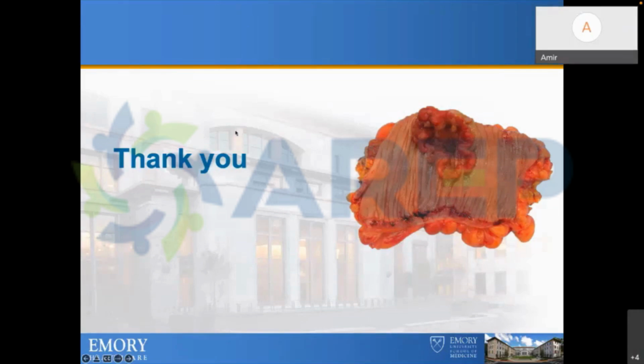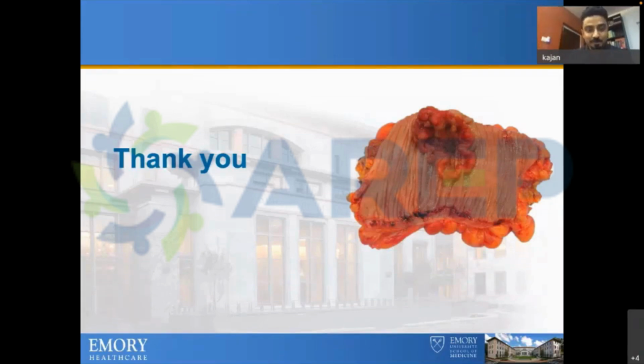Thank you, Dr. Amir. That was really a wonderful talk, very elaborate and very illustrative throughout, from the protocol to staging to restaging. And I fully agree about using a structured template, which kind of gives you a checklist also. I have a question from one of our audience. How do we differentiate a residual tumor from fibrosis using DWI? I'll be glad to have an example of that, if we have an imaging example of that.